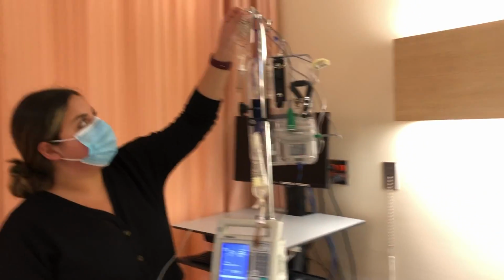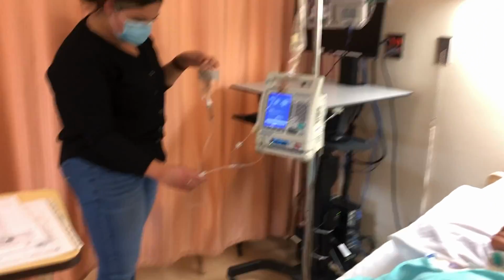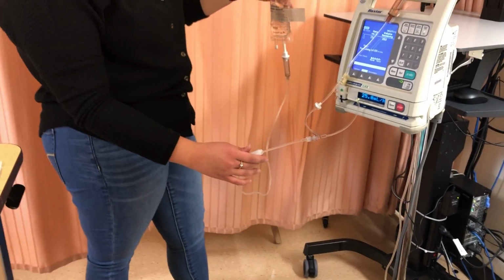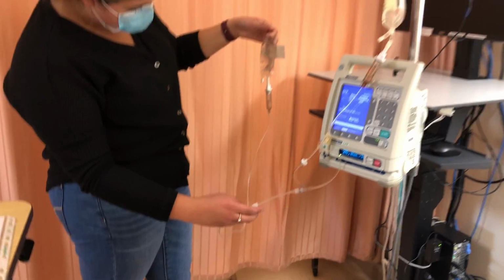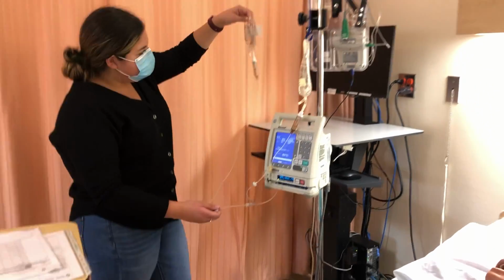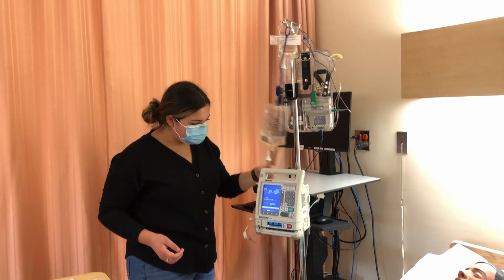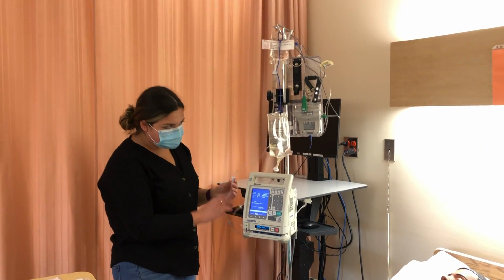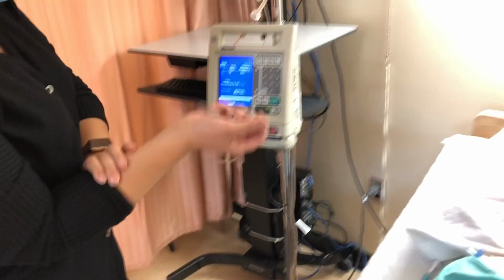So then I'm going to back prime my secondary bag. So keeping it lower than my primary, you can see the bubbles entering the secondary bag and leaving the primary or the secondary line. So that is done. Ensuring that my clamp is undone. I am now going to set my secondary rate.